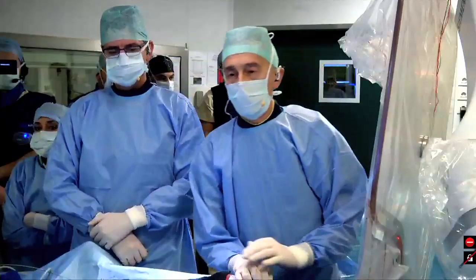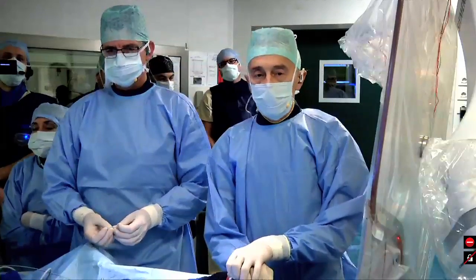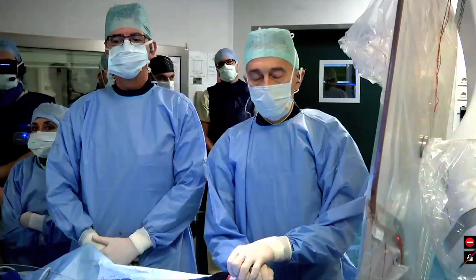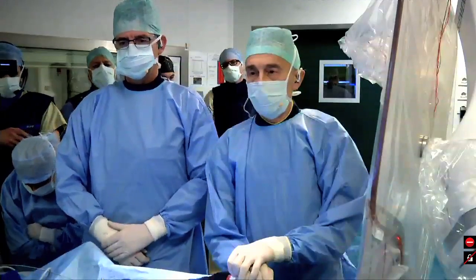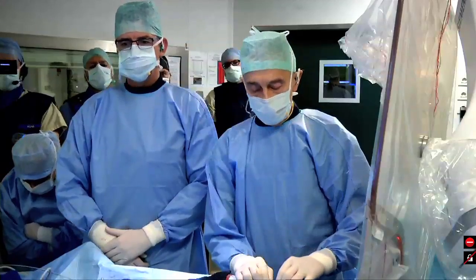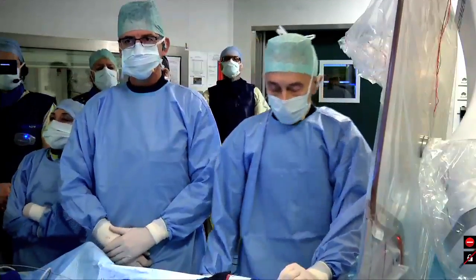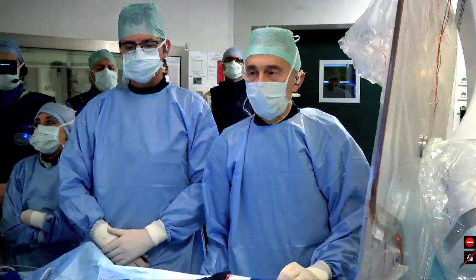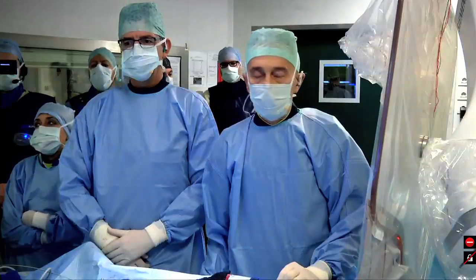Welcome back again to our center. We plan to do two procedures today by closing the left atrial appendage in two patients by using two devices. The two devices are quite similar, but they have some differences between them.